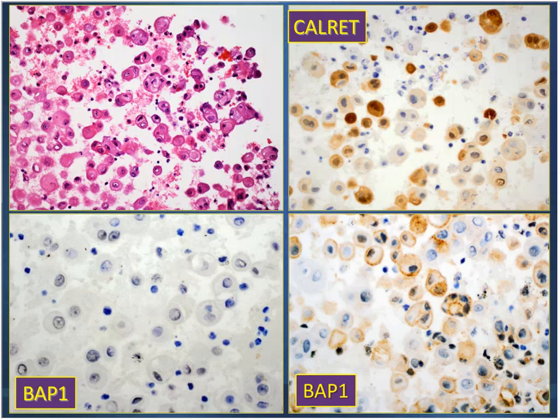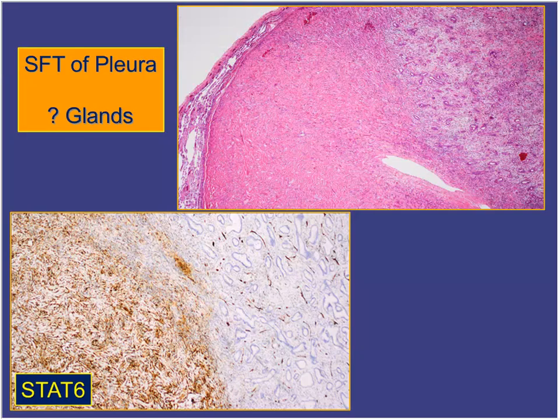So there is a nuclear loss of this particular antigen, which is useful. In absence of that, of course, we cannot be positive about it. It is somehow helpful, but it is not a very sensitive marker at this time, at least with the antibodies which are now available.